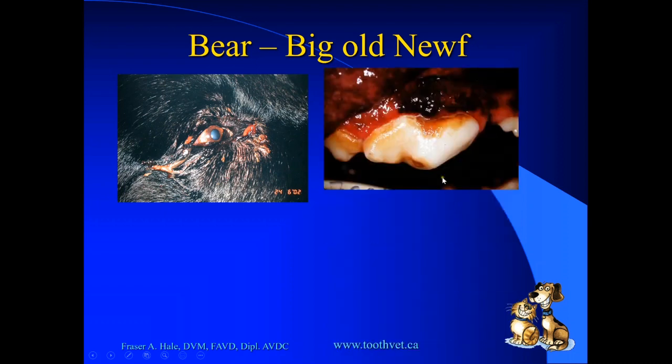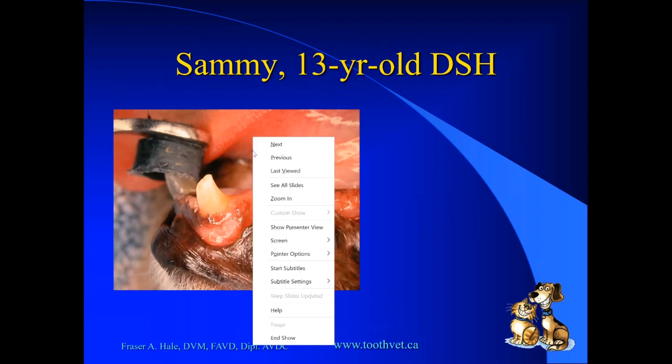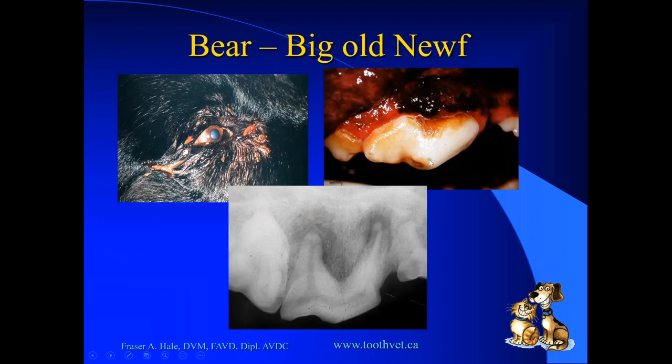The problem was the fourth premolar. The right upper fourth premolar had an uncomplicated crown fracture with dentin exposure, and when we get our radiograph, we see quite dramatic bone loss around the tips of all three roots. And the infection had gone in through the dentin, killed the pulp, out through the root tip, causing infection and bone loss around the root tips, and then it had fenestrated through the bone into the nasolacrimal system. So the purulent discharge was draining up through the tear ducts and making itself visible at the eye. But the problem was never with the eye. The problem was always with this tooth. And if somebody had taken a radiograph of that at first presentation, it could have been treated appropriately at the first instance and saved a lot of time and a lot of money for the owner.